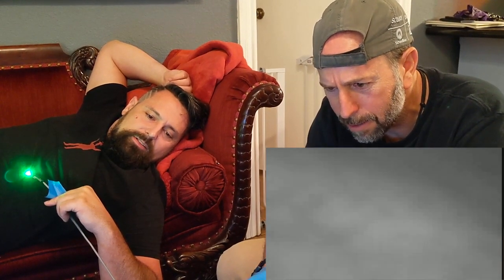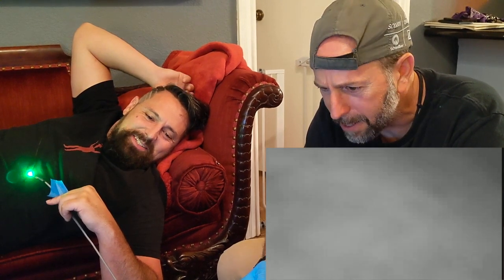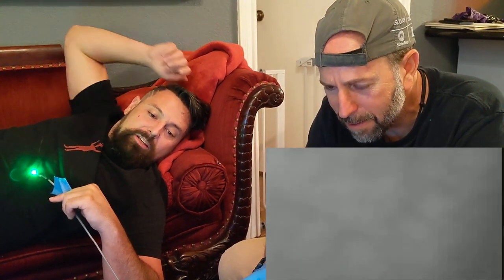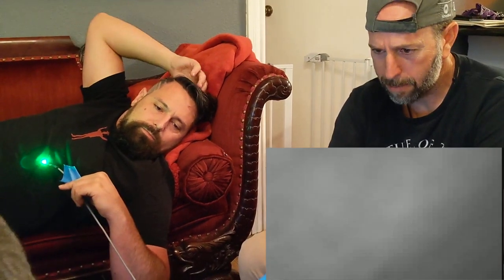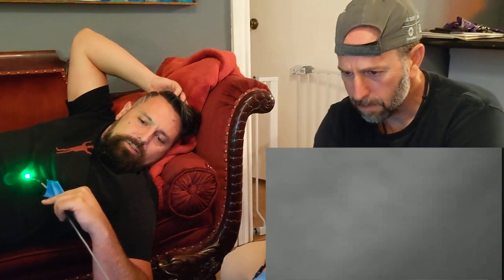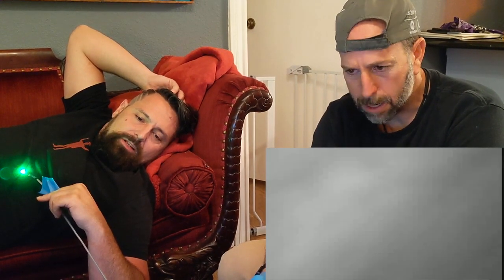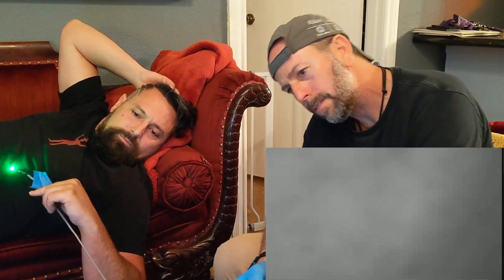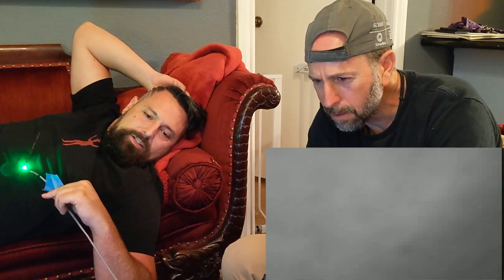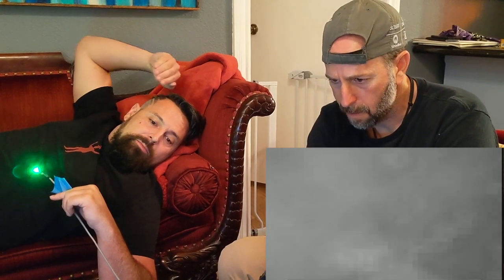We are scanning Tori's stomach. I'm going to go this way. Can you feel it? No, I can't feel anything, which is weird because you can hear it buzzing like it's in your mouth or something. Oh, you can hear it right now? Backing up. Great video and complete control — I am driving all over your stomach, front to back, left. The resolution we're playing with right now is literally just anything to get started, but we have image compression coming soon. And with that new radio, you get way more frame rate, much higher resolution.